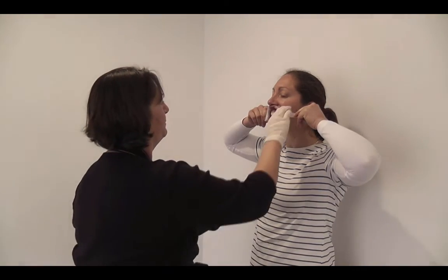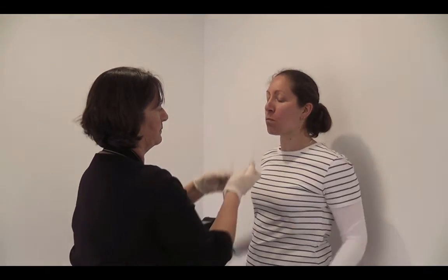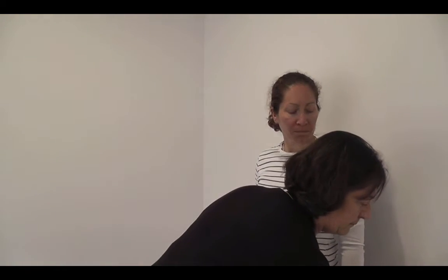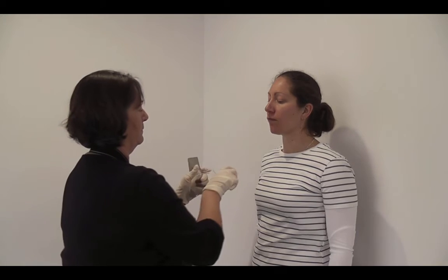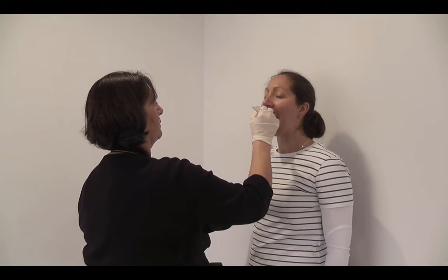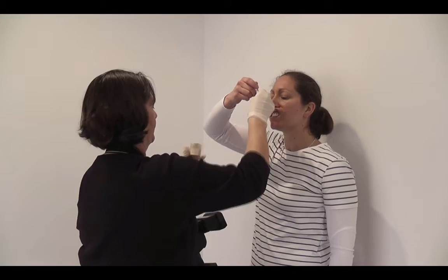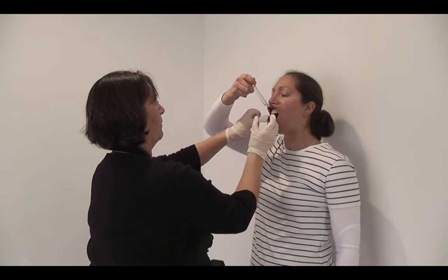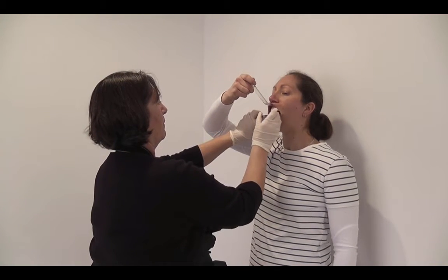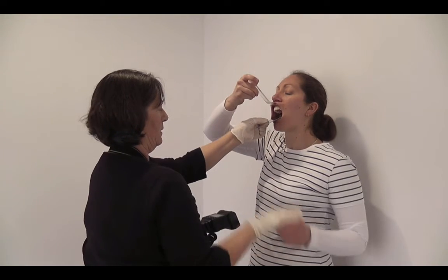Finally, take the maxillary and mandibular occlusal photographs using the occlusal mirror and lip retractor. The camera aperture setting is now at 32. It is recommended you warm the mirrors prior to placing them in the mouth, as this will prevent fogging the mirror so that we have a clear view of the whole occlusal arch. Don't have them too hot or they could burn the mouth.